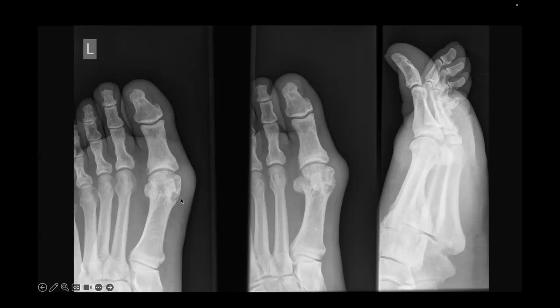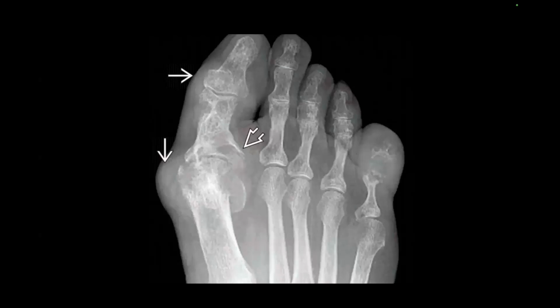This is an example of a patient with classic great toe gout arthropathy, but with subtle radiographic changes. You've got this erosion here at the juxta-articular surface. Is it really an erosion, or is it an enthesopathic cyst forming at the ligament attachments? You've got soft tissue density at the medial aspect of the joint, subtle areas of mineralization, and no erosions at the articular surface. But this patient went on to have a needle aspirate and was found to have urate crystals, so was diagnosed with acute gout inflammation.